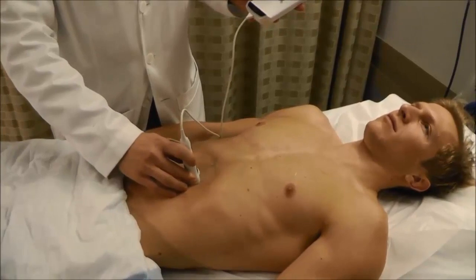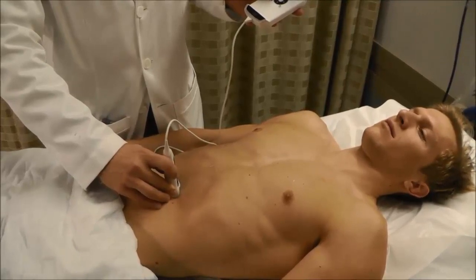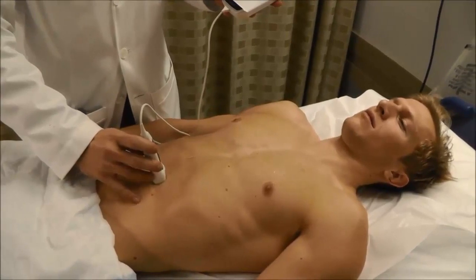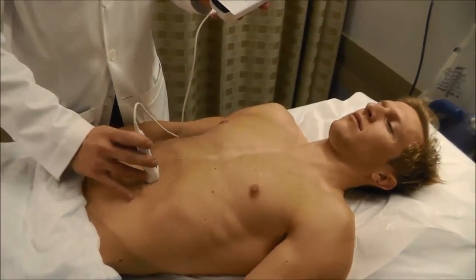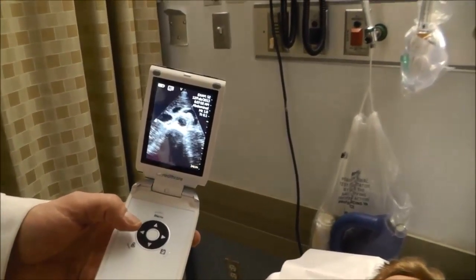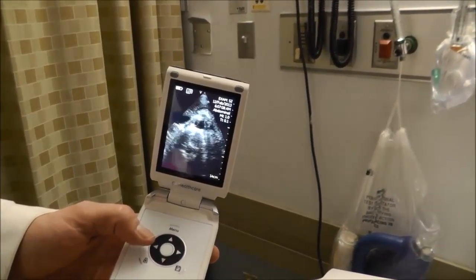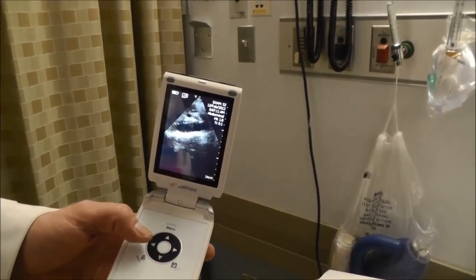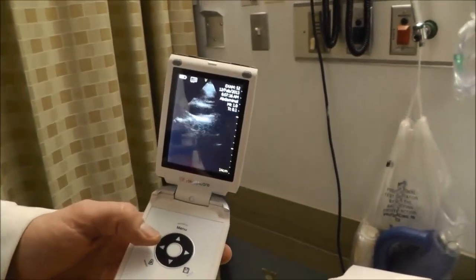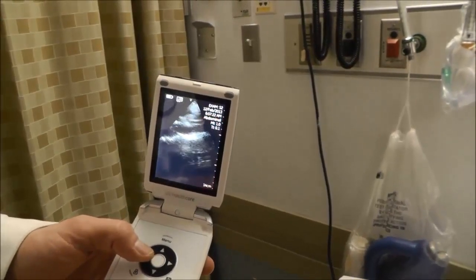We follow the entire aorta in a transverse plane, watching it on the screen as we follow it down to the bifurcation, where we'd like to see the aorta split into the iliac arteries. To also get a longitudinal view, we start with our transverse view showing the aorta and the superior mesenteric artery above it, then rotate the probe 90 degrees so the probe marker faces towards the patient's head. Now we can see the abdominal aorta in its long view, looking like a tube. That is how we assess the abdominal aorta.